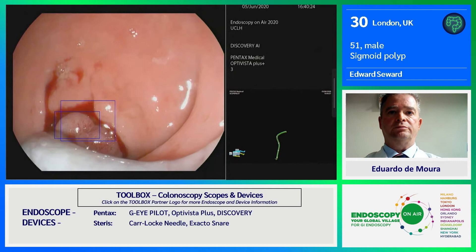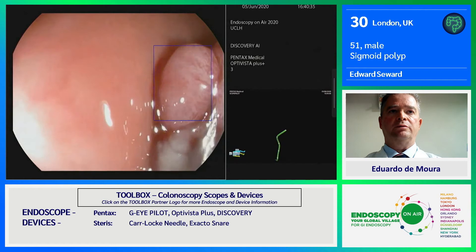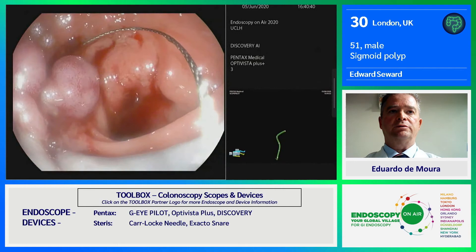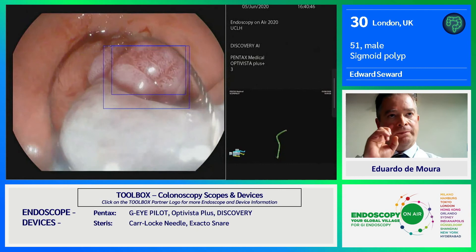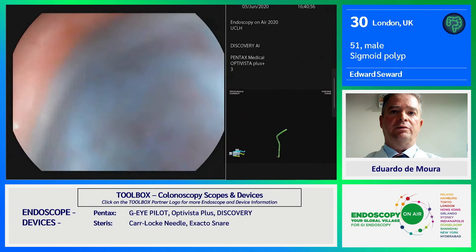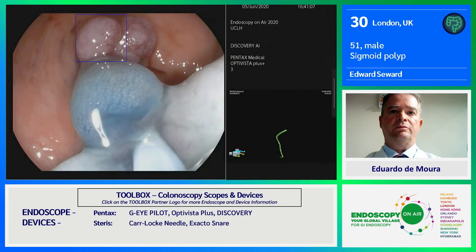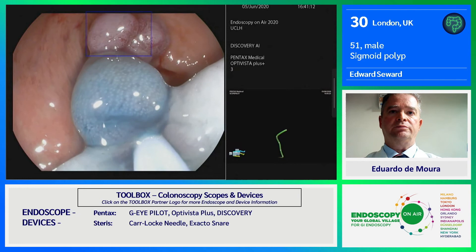What we try to do is open past the lesion and allow the polyp head to fall into the snare. Just going to go on the other side — that's going to be easier. You can see the polyp head is just falling in. Close there. It's very good to have full visualization of what you are doing at all times, so you have full control that the snare is safe and that you are not getting any normal mucosa trapped — therefore the complication rates are much less.